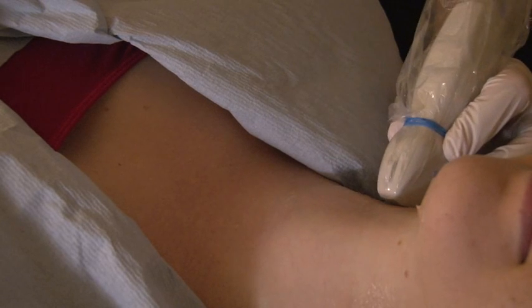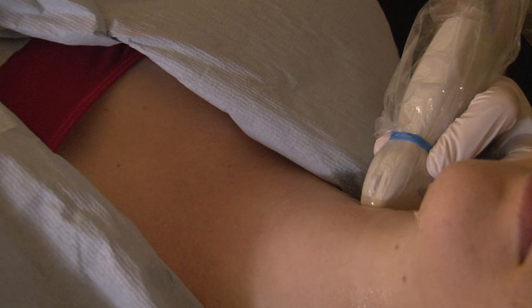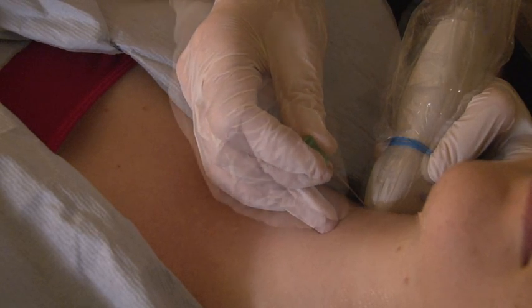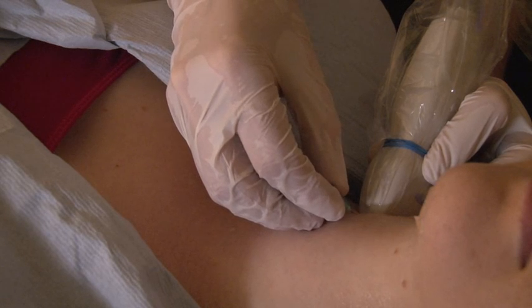The procedure may be uncomfortable but, in a recent survey, 88% of our patients described the procedure as painless or only mildly painful. Cells are removed inside the needle and the sample is then sent to be looked at under a microscope by specially trained doctors.